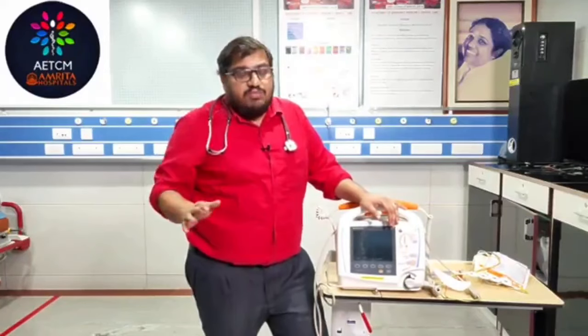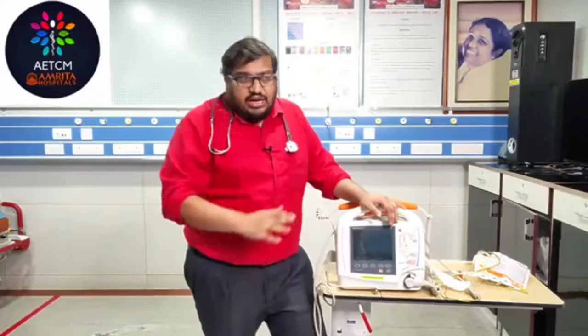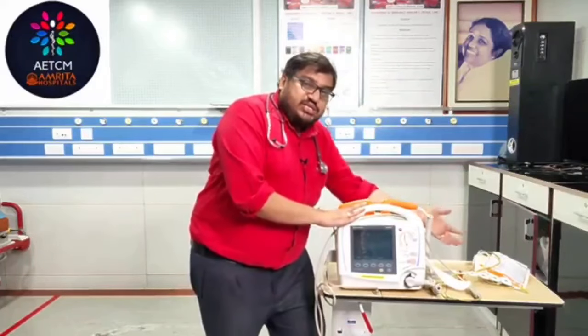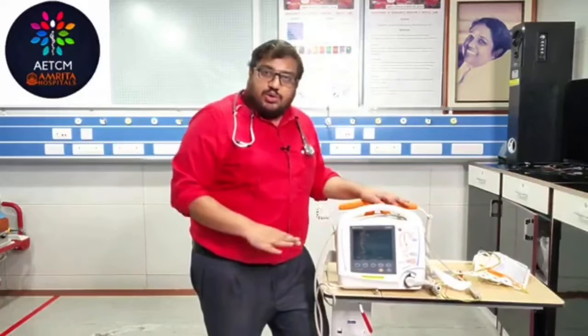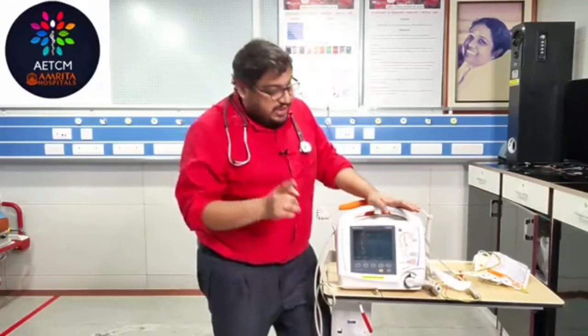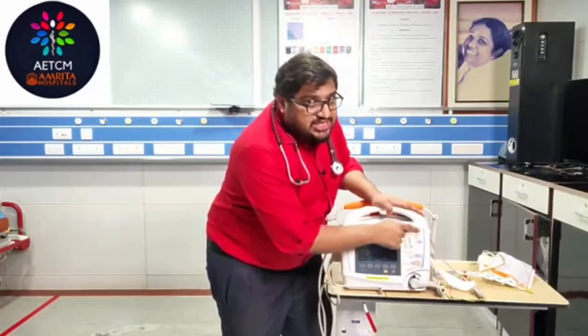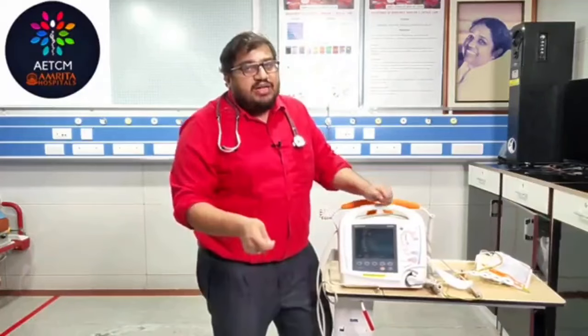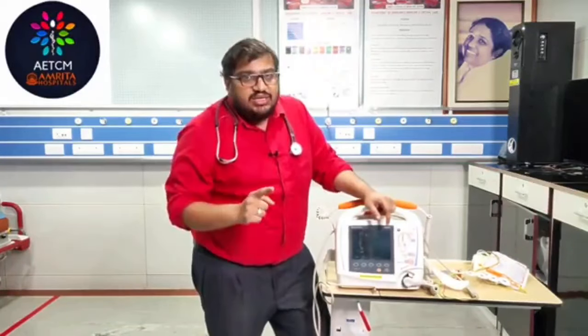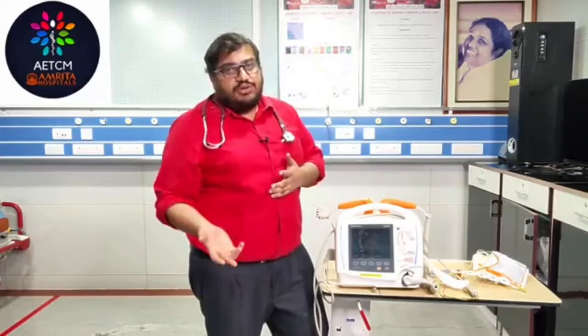Cardioversion, the procedure is the same. We have told, we have to get consent. The parts, everything is the same. You can use either adhesive paddles or the routine paddles, and you need to deliver the shock. But remember that you need to switch on the sync button and keep the paddles at least for another 2 seconds, so that the machine will recognize the rhythm and it will deliver the shock. And depending upon what happened after the shock, you can decide on further treatment.